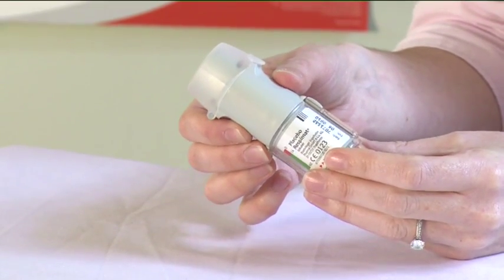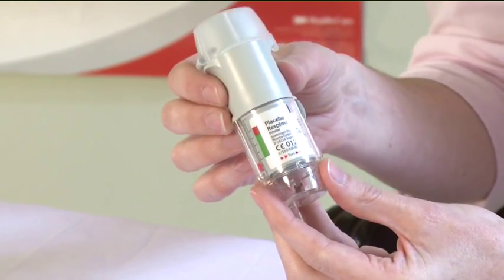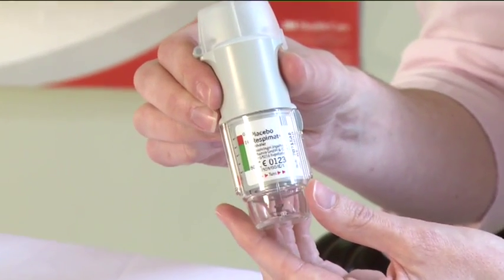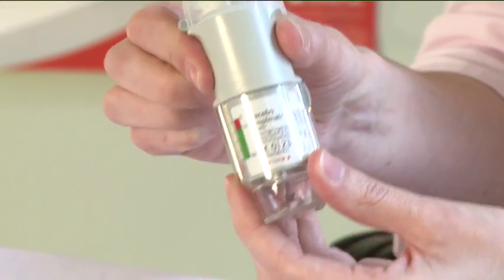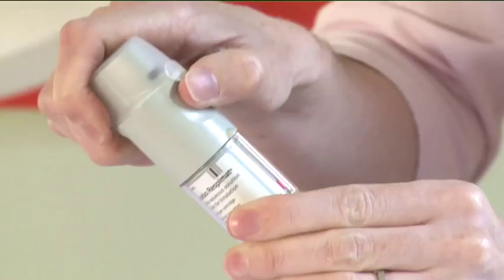To prepare the Respimat inhaler for the first time, hold the Respimat inhaler upright with the transparent cap closed on top. Turn the clear base in the direction of the red arrows on the label until it clicks. Open the transparent cap until it snaps fully open.